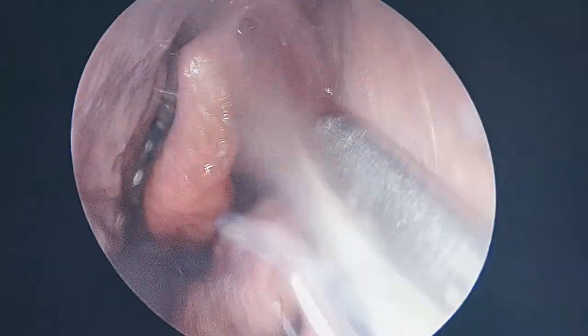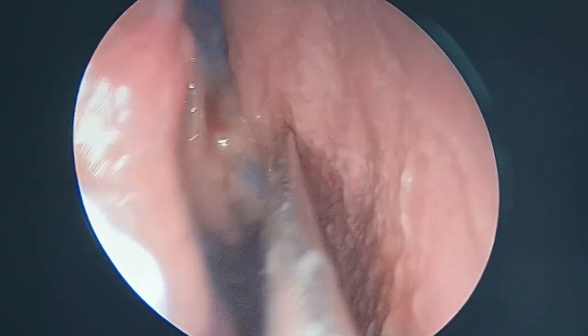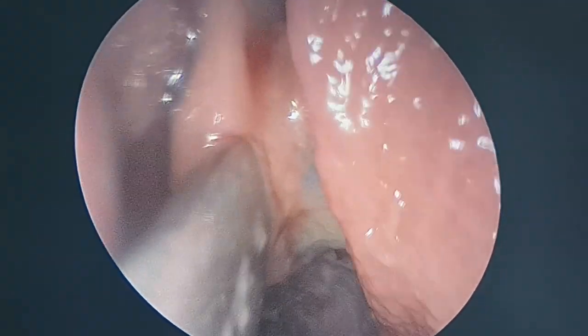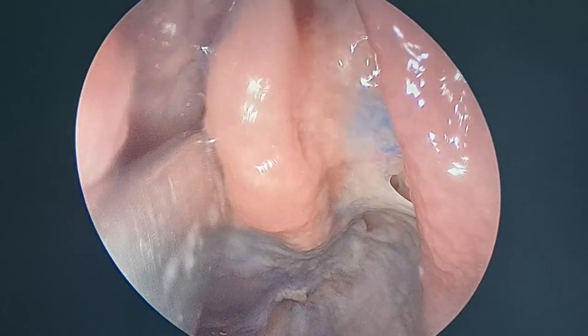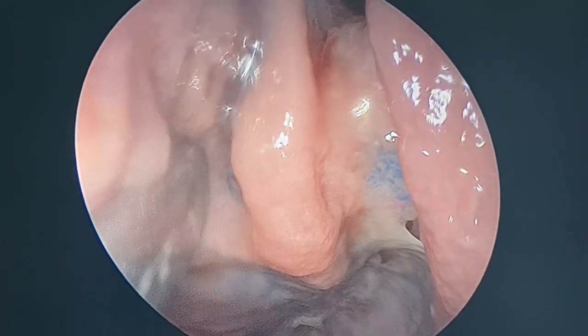That is important in surgery when you have massive polyposis and it is difficult to identify the uncinate, and sometimes the uncinate is distorted. You can identify it many a time by means of its mobility. Then behind the uncinate is another prominence, that is the bulla ethmoidalis. This is part of the anterior ethmoid cells, and behind the bulla is the second part of the middle turbinate.